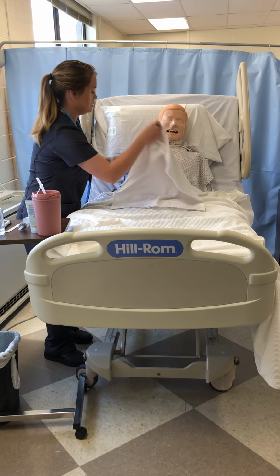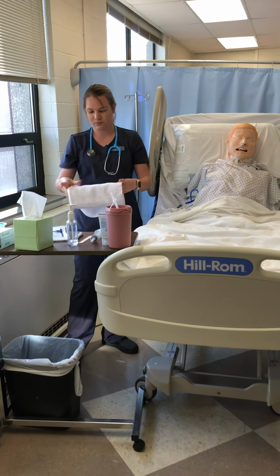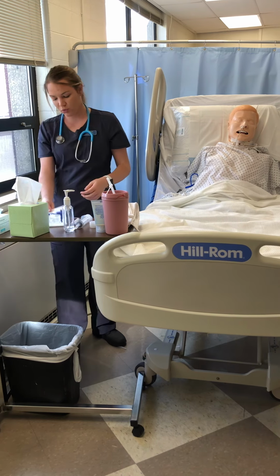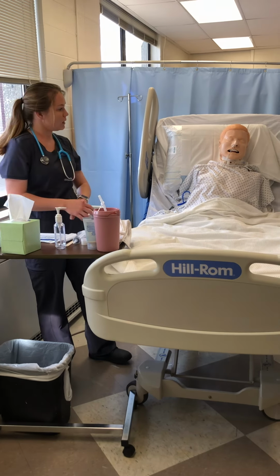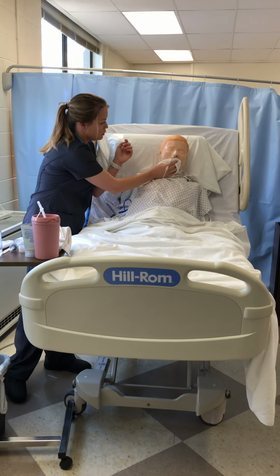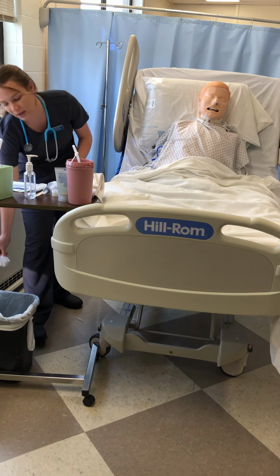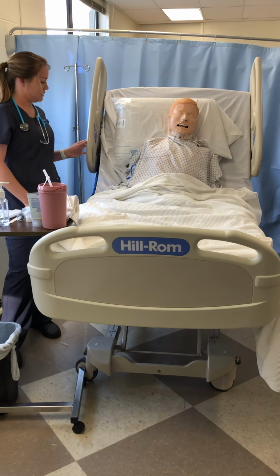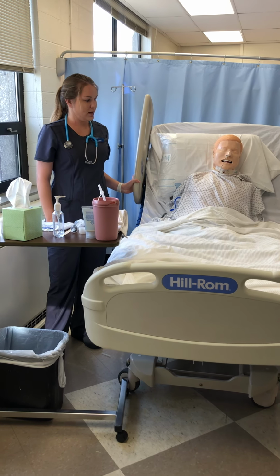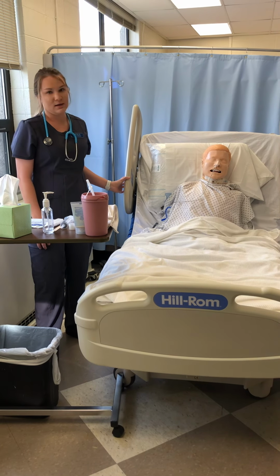I'm going to take this off, throw this away in my dirty linens. I would clean up my table, and then I'm going to see if he wants to wipe his nose and clean up a little bit, and then I am going to document everything I did. I'm going to say that I inserted it, what tube I inserted, what I got when I aspirated, and the date and the time.